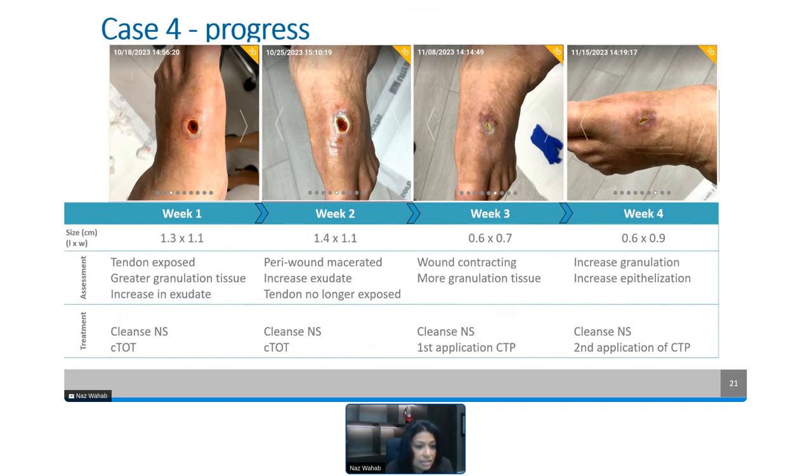Look at the image and see the edema here, and see how the edema has actually decreased at week 2 with just one or two applications of the topical oxygen, or two weeks of the topical oxygen, I should say. That is really quite remarkable, that there's so much decrease in peri-wound edema. This gentleman obviously has a Charcot foot as well, and decreasing all of that edema is very important in controlling that Charcot as well.